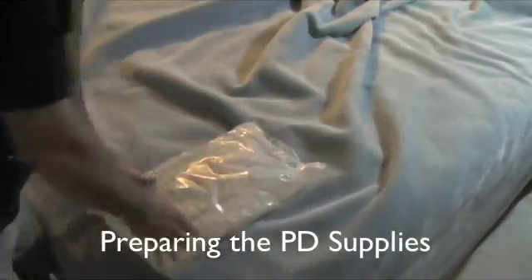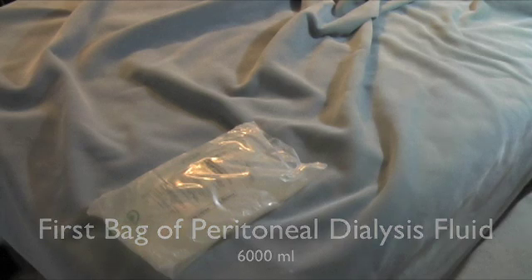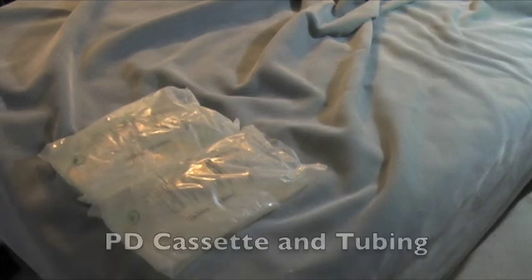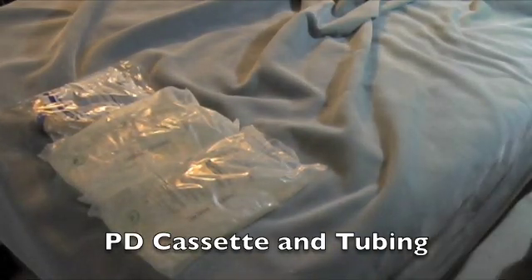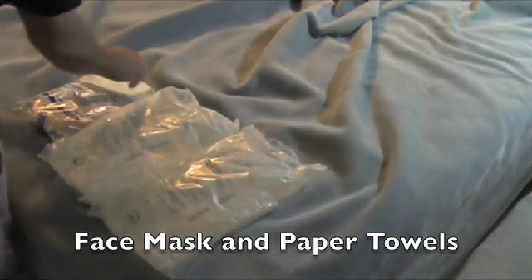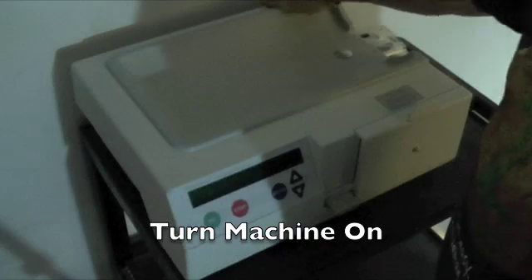The next thing I'm going to do is start preparing my peritoneal dialysis supplies for the cycler. I'm going to take out the bags of fluid I need — in my treatment I use two bags of 6,000 milliliter fluid bags, though other people use three or four bags depending on their treatment. I'll also take out one of the cassette set tubing cases, get my face mask ready, and get paper towels to wipe down the bags of fluid. Now I'm going to turn the machine on and get it ready.